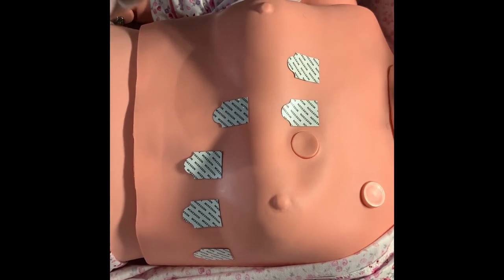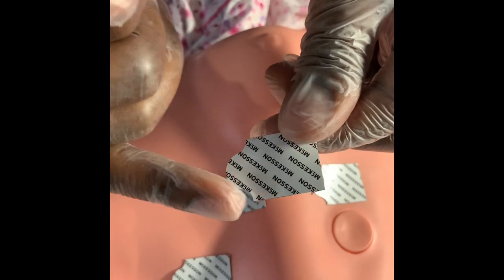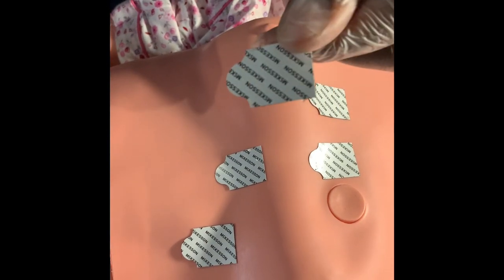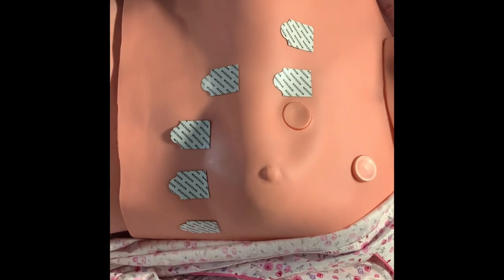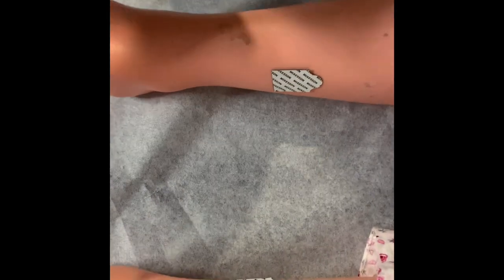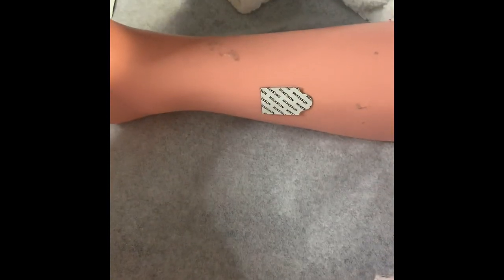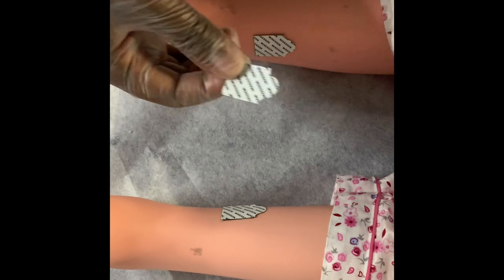I'm talking about this curved, crescent-shaped part — it's facing towards the ground on the patient. Everything on the upper part of the body, on the arms and the torso, all facing towards the ground. On the lower part of the body — the legs — you want to make sure the electrode is facing upwards.